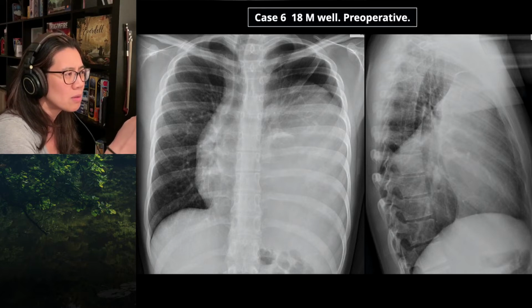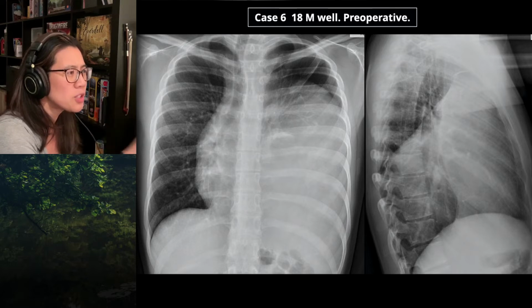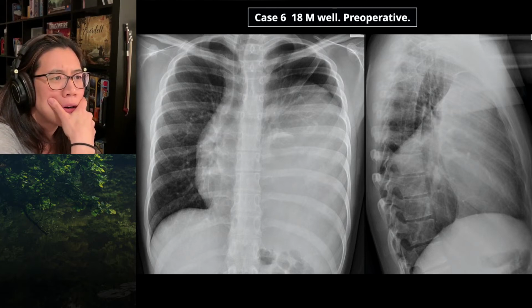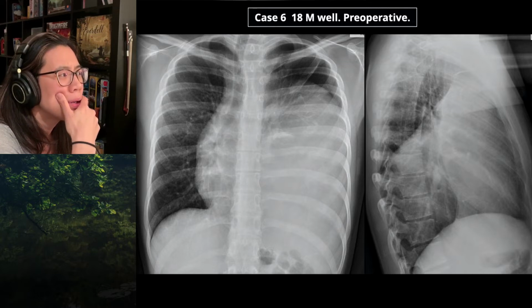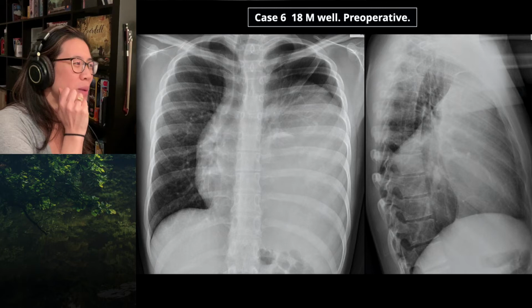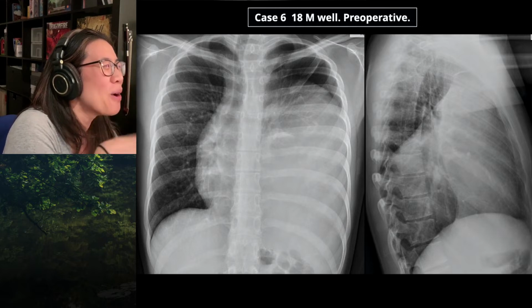The opacity stops at the level of the fifth vertebral body, posteriorly. On the lateral view, it stops at the level of the manubrium, I think, which is the thoracic inlet. So now you said the whole trachea is deviated. For the benefit of the registrars, what are the parts of the trachea? Oh, crumbs, now you're pushing me. No, it's simple. The superior bit, the middle bit, and the end bit. There's a bit above the manubrium and a bit below the manubrium.